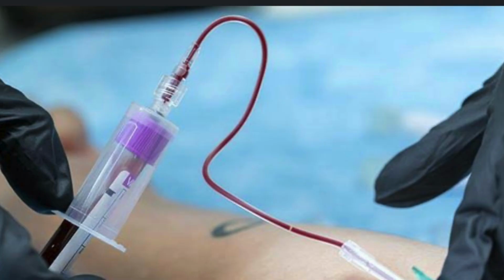For the purple top tube, we invert the tube 8 to 10 times. As I mentioned, with the light blue top tube we invert 3 to 4 times, and the red top tube we don't invert because there is no additive.